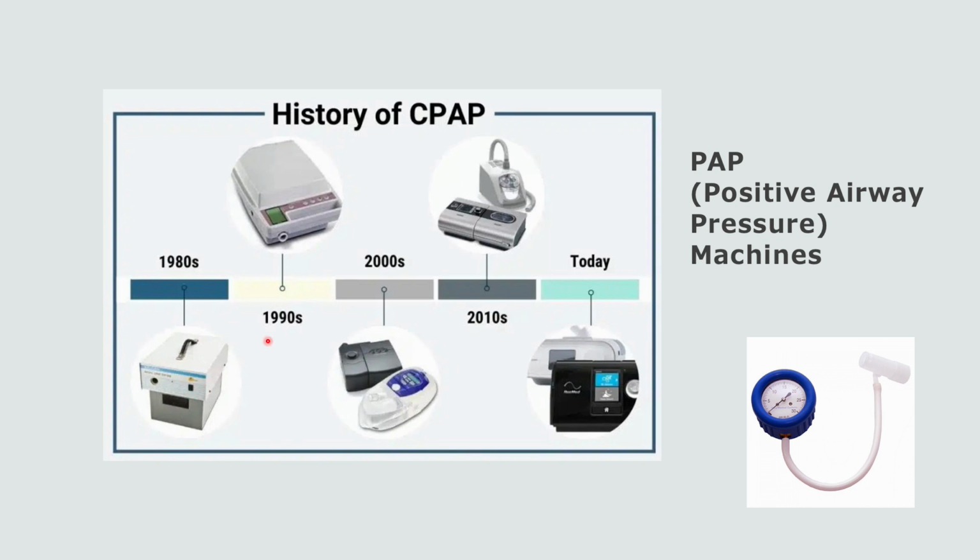In the 90s, you start seeing humidifiers that are sold separately, and that could be placed under the CPAP machine. The 2000s brought humidifiers as standard on CPAP machines, and the machines are also smaller. You start getting LCD screens that showed you some data. These machines were also when you could start holding down a couple buttons and access the clinical menu, which allowed you to change the settings and pressure.